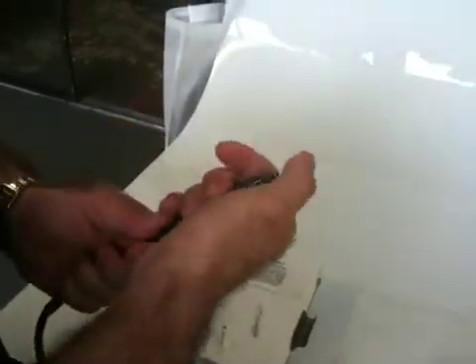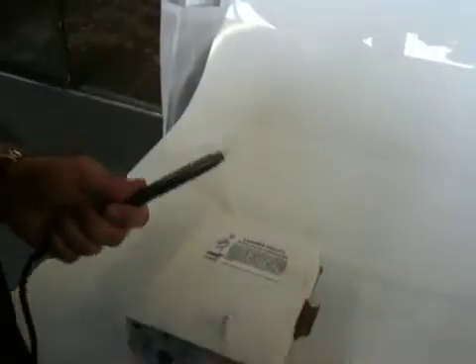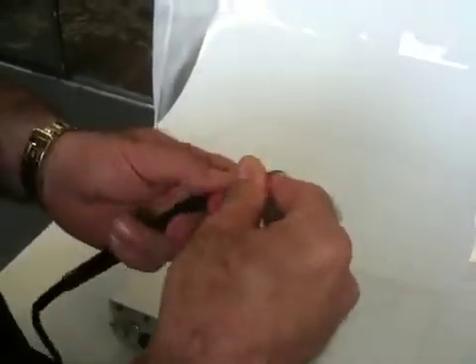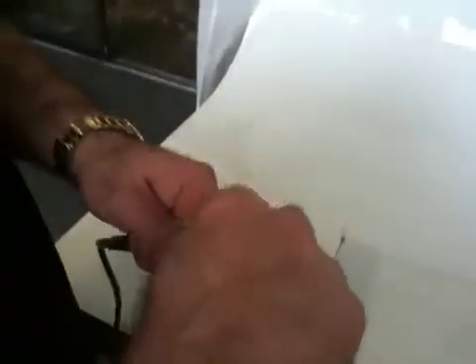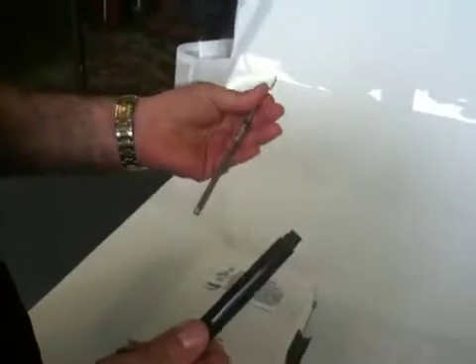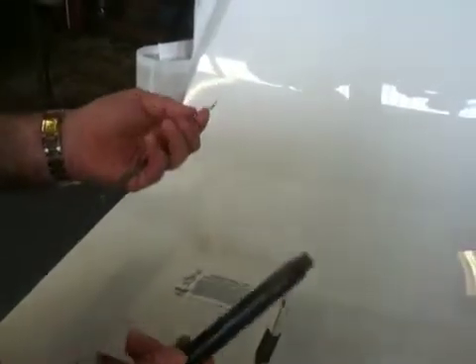Now, it should come out pretty easily, but sometimes water makes it have suction. You can use the tip in this case — screw the tip back in and then use the tip as leverage to pull out the insert. That is the proper way to remove and insert the insert in the Sonus handpiece.